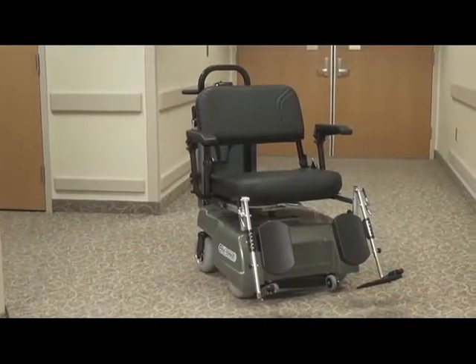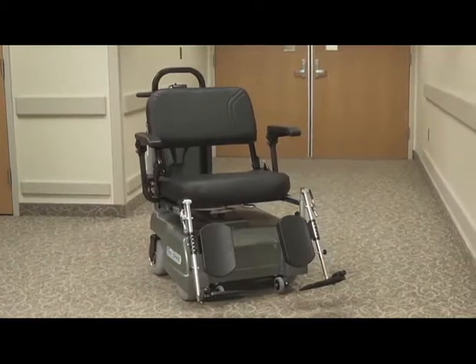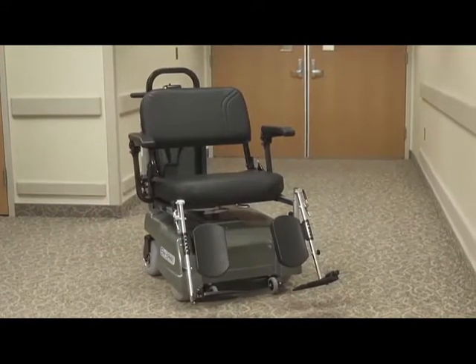In order to get the most out of your Ergo Express Patient Transport Chair, or PTC, and ensure its safe operation, please watch the following.